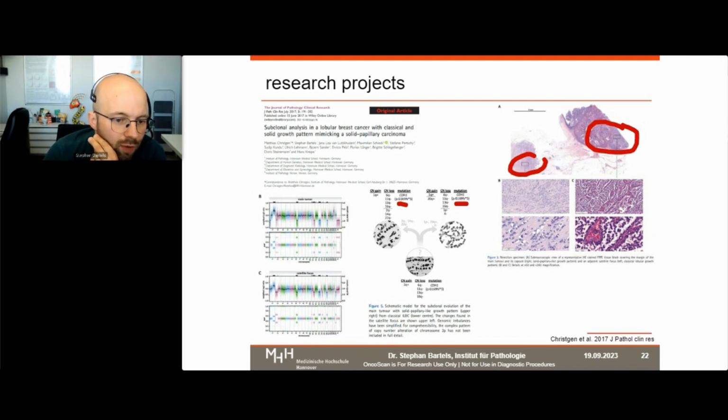They share most of them, and some are individual. So we conclude that these 2 tumor regions must have the same ancestor lesion and underwent a tumor evolution in follow-up.